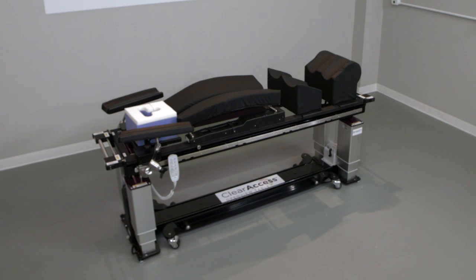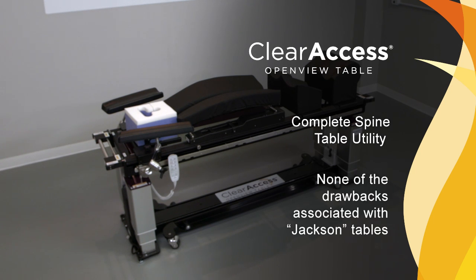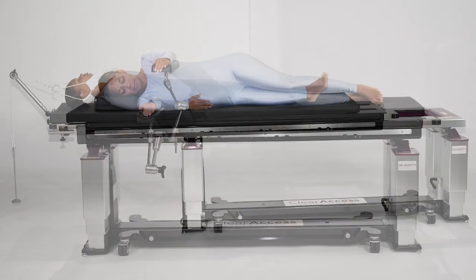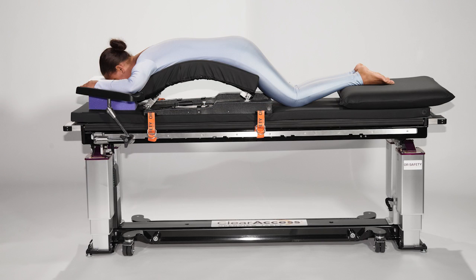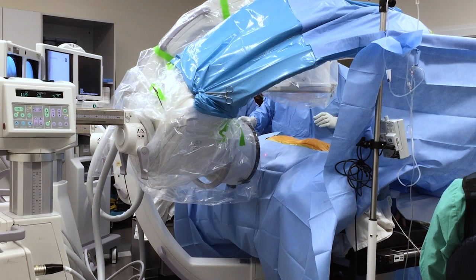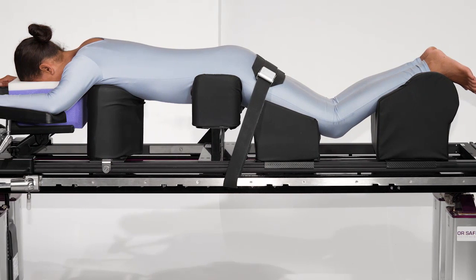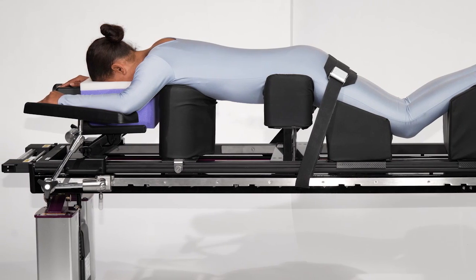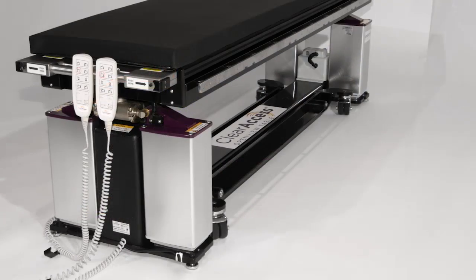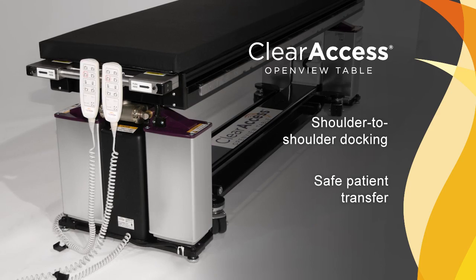The Clear Access spine surgery table by OR Safety was developed to maintain all of the utility of competitive spine tables — generically referred to as Jackson tables — while removing all notable drawbacks of those systems. The table maintains head-to-toe C-arm access for lateral, anterior and posterior spine procedures and can support the simultaneous use of two C-arms. While maintaining unrestricted C-arm access and providing target site radiolucency, the Clear Access table has a safe working load of 600 pounds and a noticeably more stable operating surface, particularly for heavier patients.